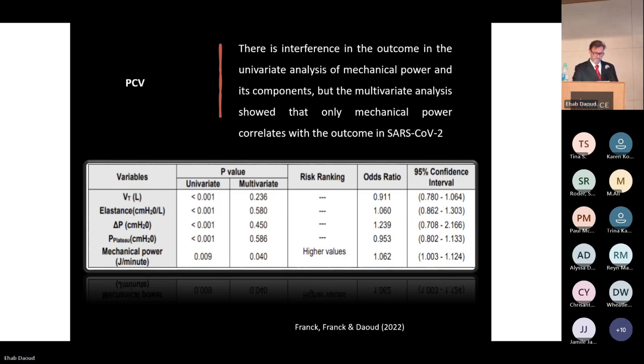But the multivariate analysis showed that only mechanical power correlates with the outcome in pressure control ventilation.